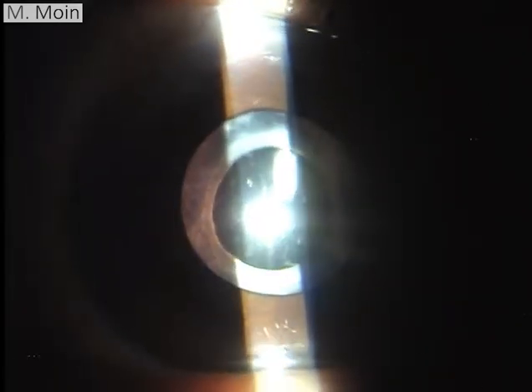On retroillumination, the red reflex tells you that the retina is most probably flat in this patient. Looking at the disc with a superfield lens, we can identify the disc on the first go and assess whether the retina is attached or not. The cup-to-disc ratio seems to be 0.3 in this patient. The reason I'm showing you in this way is that in an examination you will have similar findings where sometimes the view comes in and sometimes it goes.